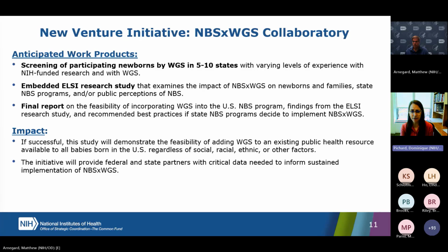If successful, the study will demonstrate the feasibility of adding whole genome sequencing to an existing public health resource available to all babies born in the U.S. The initiative will provide federal and state partners with critical data needed to inform sustained implementation of NBS by whole genome sequencing.